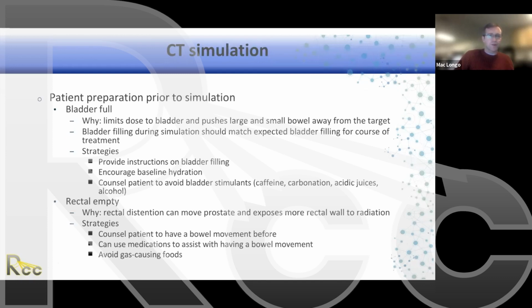Typically, and I'm sure you're all well versed, and I'd love to learn what your practices are, we simulate the patients with their bladders comfortably full. And I want to emphasize comfortably full. In my experience, I have gentlemen that are so concerned about having their bladder full that they drink so much water that their bladder reaches their diaphragm or their lungs for the day of the sim, but it's a bladder filling that they cannot reproduce subsequently on a daily basis for their 20 or 28 treatments. So I really want to emphasize comfortably full.